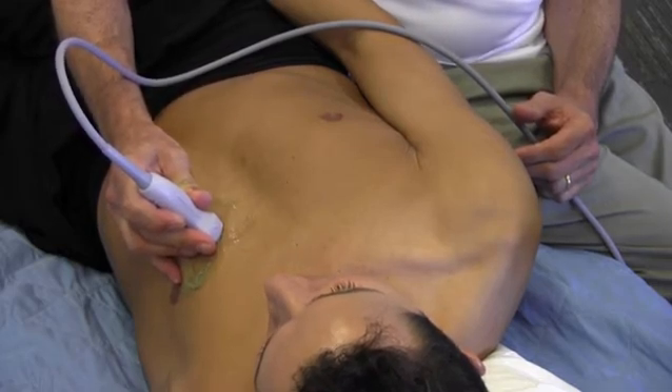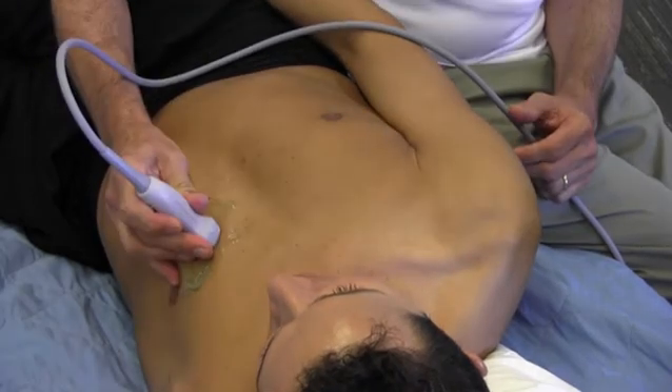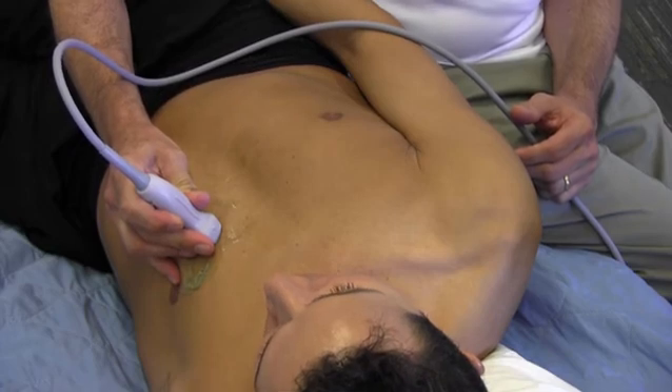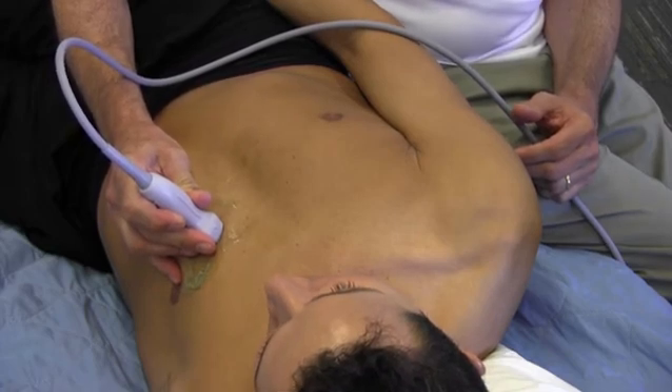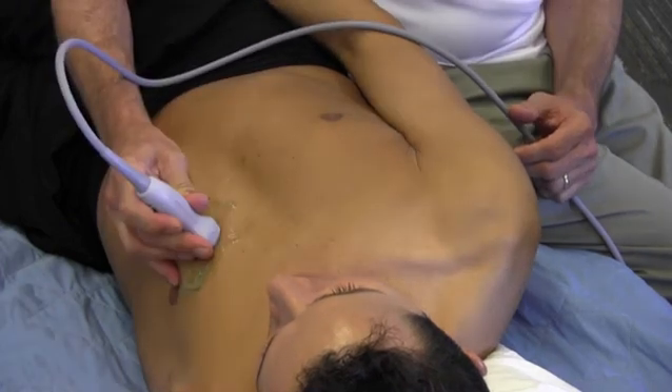Now someone will ask, which hand do you use? You have to get used to the fact that if you're scanning from one side or the other, you'll have to use either the right or left hand. This is just a matter of training yourself to be ambidextrous.